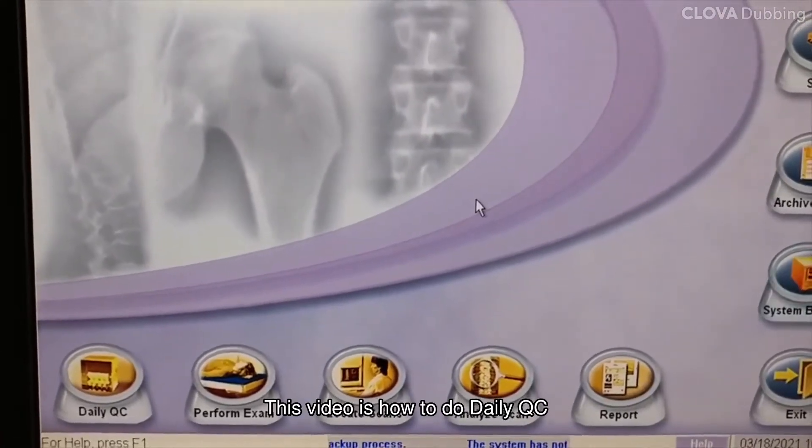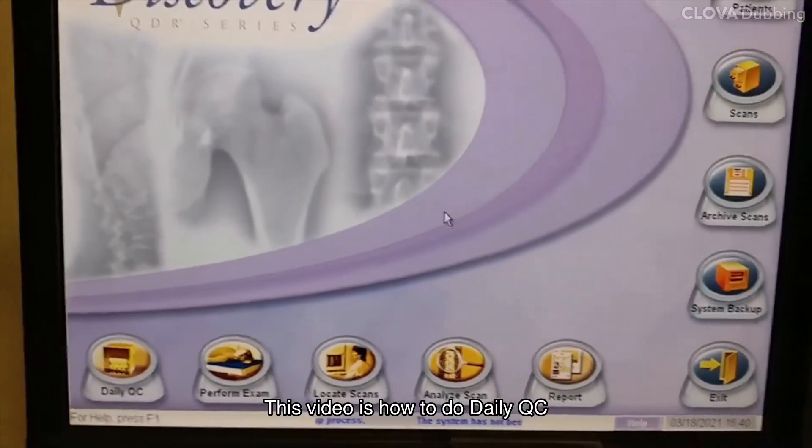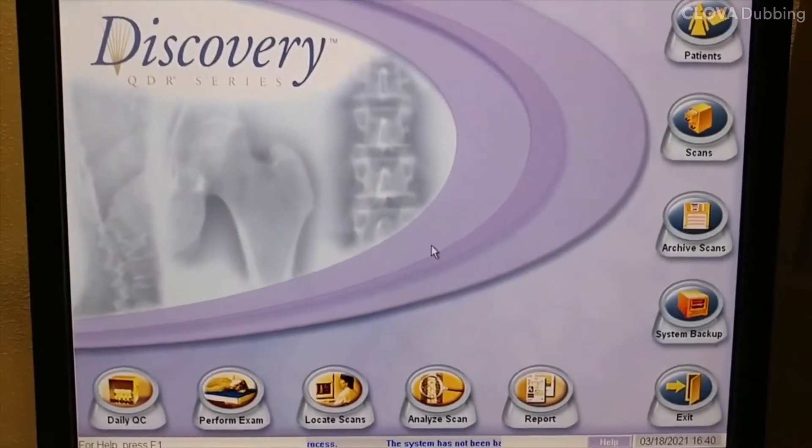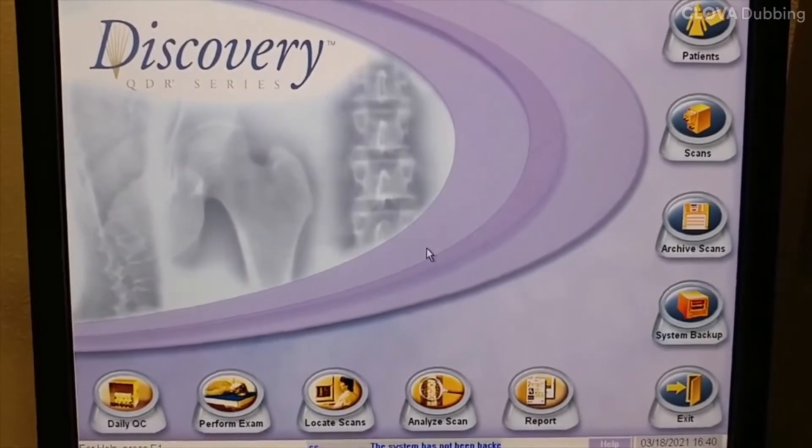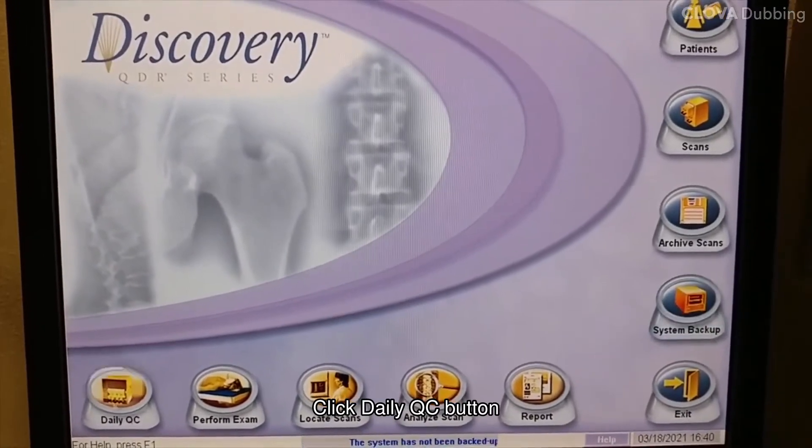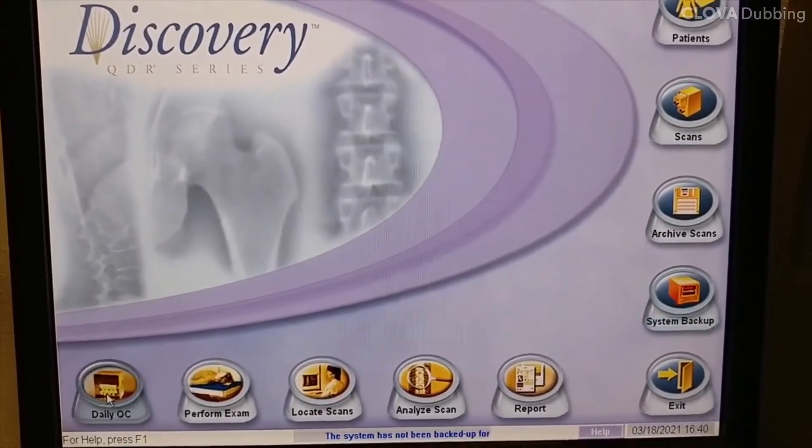This video is how to do daily QC. Click the daily QC button.